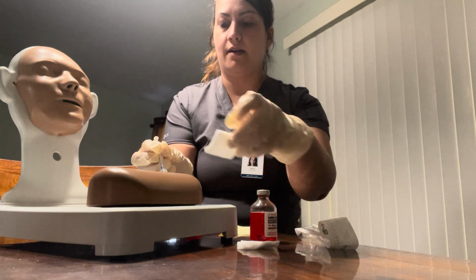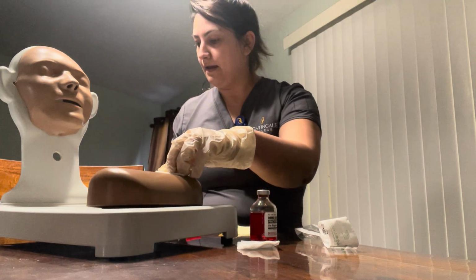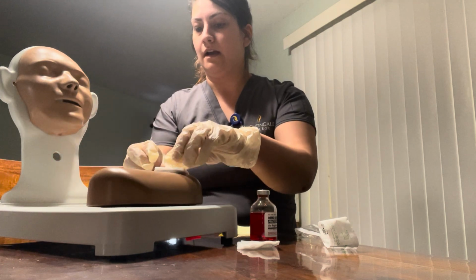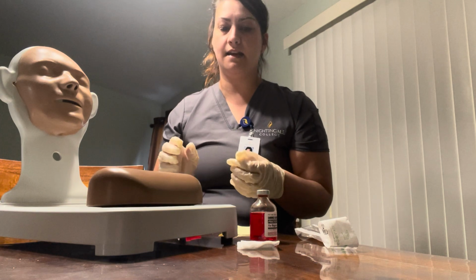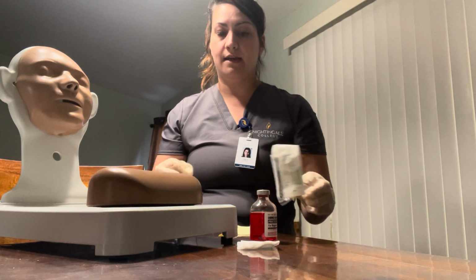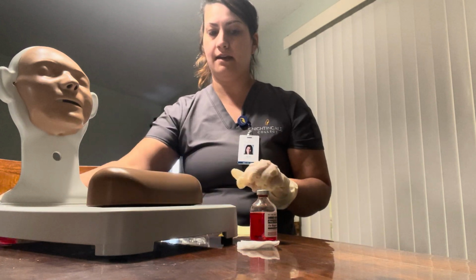And I will grab a gauze, and I will discard it in the sharps container, biohazard. I'll lightly do that and take it off. I will put a Band-Aid on as needed, and I will discard everything. I will not recap my needle, and I will discard everything.